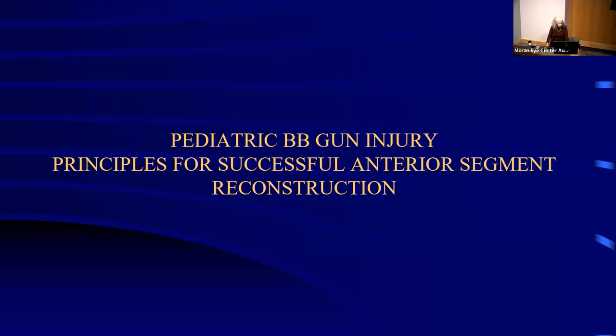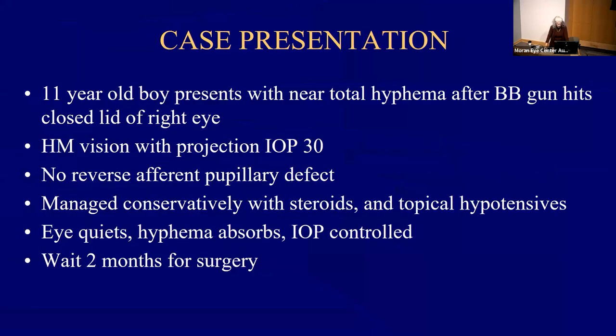Okay. This is a case that I'm very proud of. It was a very challenging case. An 11-year-old boy presented with near total hyphema after a BB gun hit, theoretically, his closed lid of his right eye. He had hand motion vision with good projection and an IOP of 30.